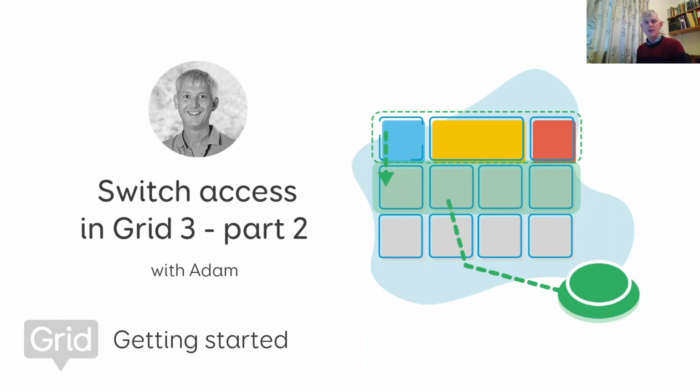So what I thought I'd start with today is just to say about who this webinar is for. We're going to assume in this webinar that you already have established the right switch and the right switch position for the user, for someone who's going to use a switch. That you're interested in fine-tuning that switch access, so looking at some of the more advanced options to either improve efficiency, speed, reduce fatigue, for example, and that you're aiming to also achieve something which is as sustainable as possible too.